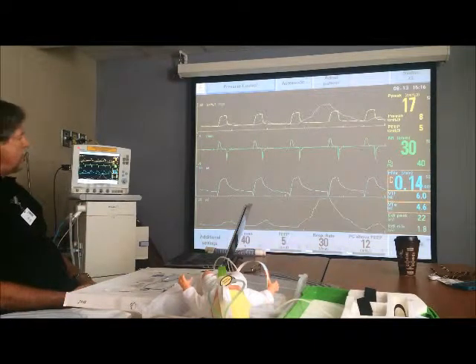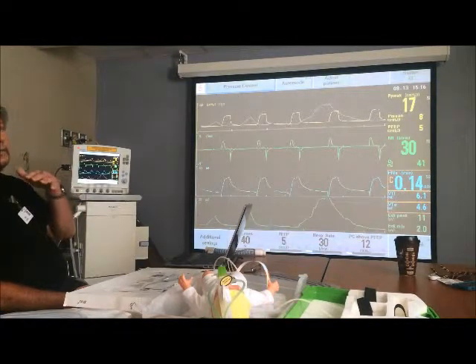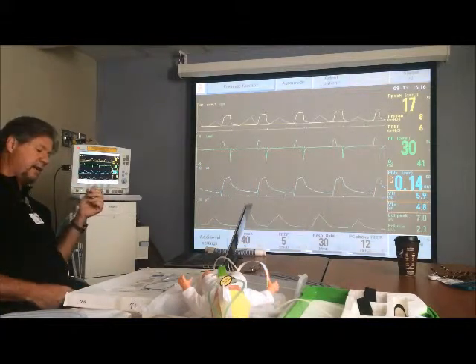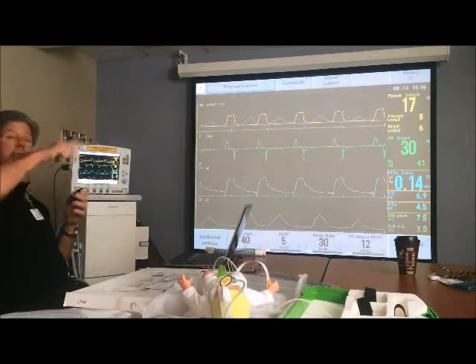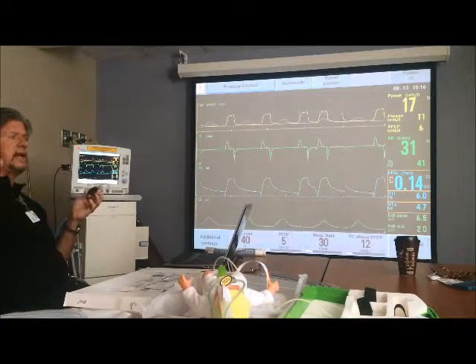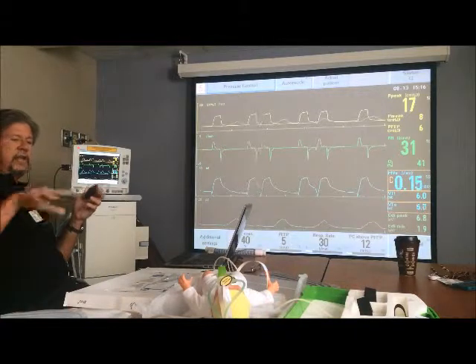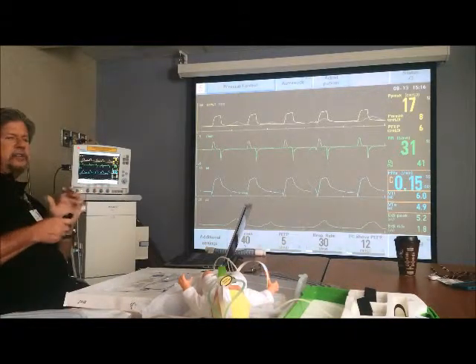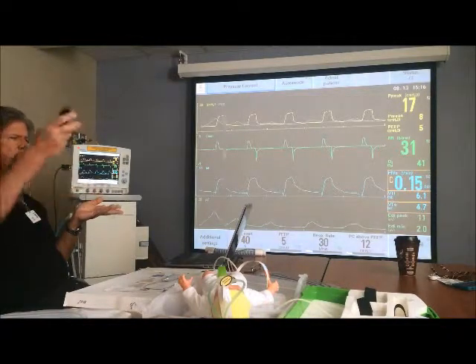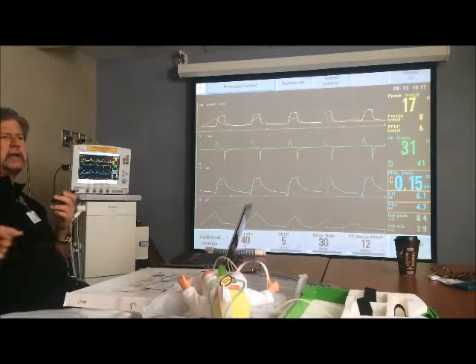Another example was at Baptist Wake Forest. They had a baby on volume support, basically pressure support, a spontaneous mode, and the trigger was, you know, purple, purple, purple. The rate was like 56 or something like that. We put the catheter in this kid, and the doctor was standing right next to me, and I said, you know, this baby's not breathing. She looked at me and said, what do you mean he's not breathing? It's a spontaneous mode. He's been on this mode for a couple of days. I said, no, he isn't. How can he be breathing if he's got no EDI?